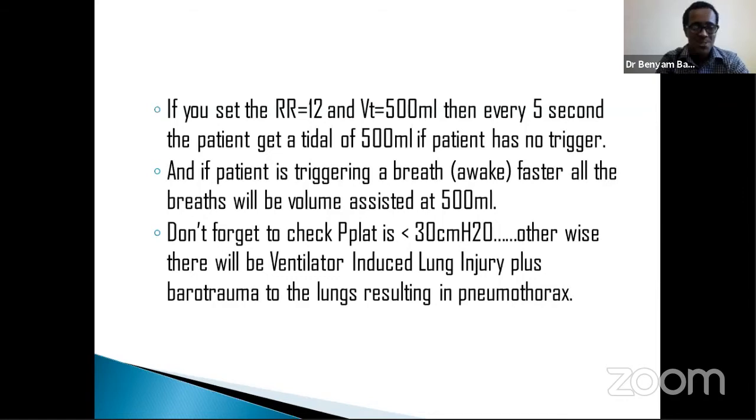We said plateau pressure should be less than 30 centimeters of water. So plateau pressure should be checked, or else the patient will develop ventilator-induced lung injury and barotrauma, resulting in pneumothorax and so on. As I told you earlier, the plateau pressure might not be displayed. In this case, we need to check the peak inspiratory pressure and maybe put on an inspiratory hold and check the plateau pressure. Or some machines may display the plateau pressure. Based on that, we should act to decrease the plateau pressure to less than 30 centimeters of water.